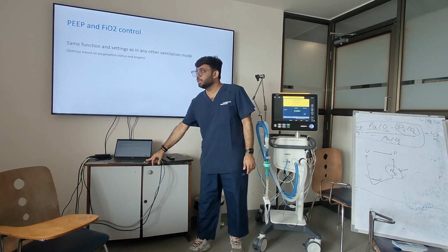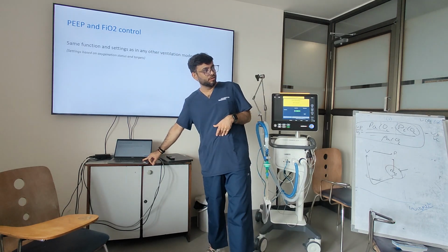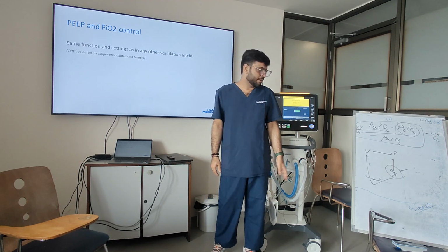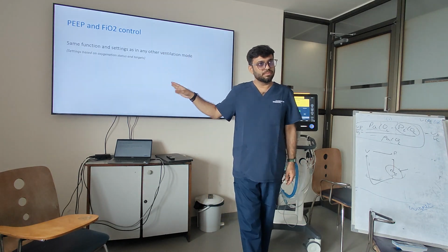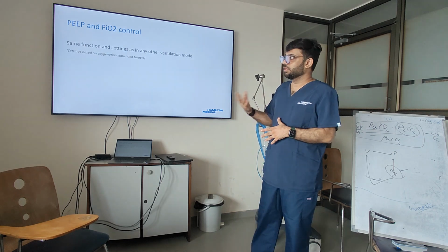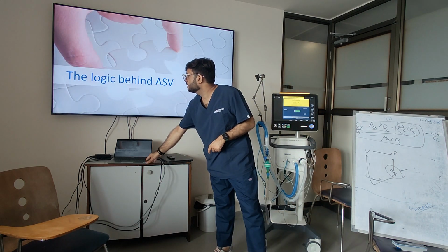Now PEEP and FiO2, as I mentioned, are the same. 30, no? 15, sir. 15. Below 15, we are considering them under the neonatal category, then your circuits and everything gets changed again. And FiO2 remains the same as the similar controllers we have in the conventional mode, and it is based on the patient oxygenation status and the target.